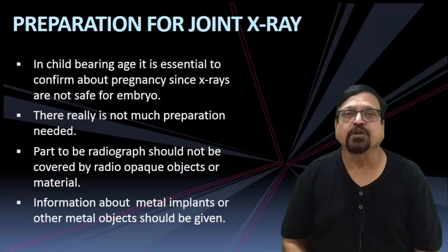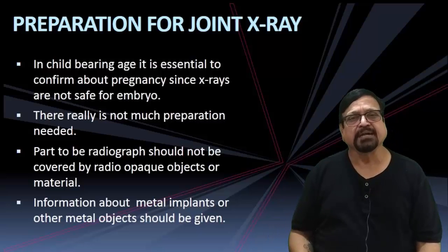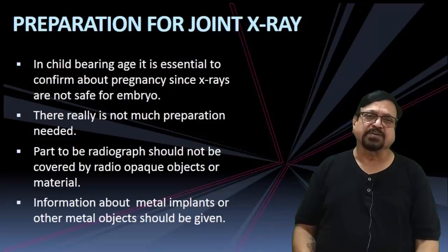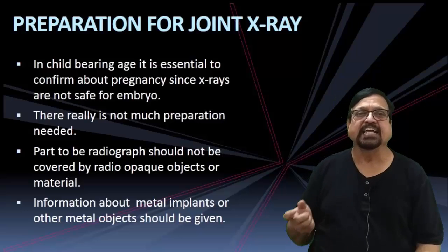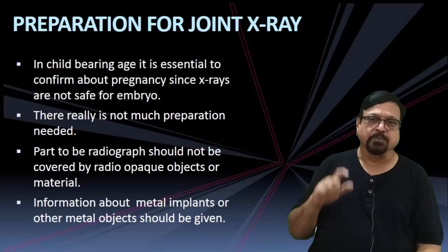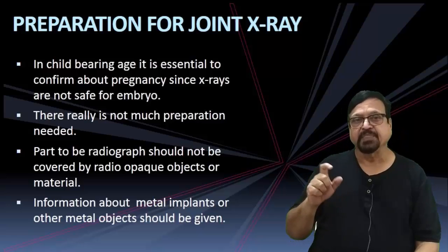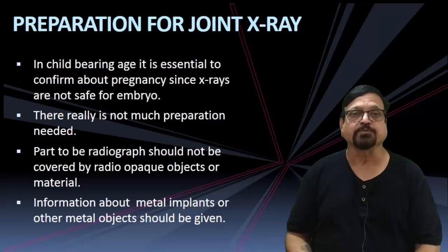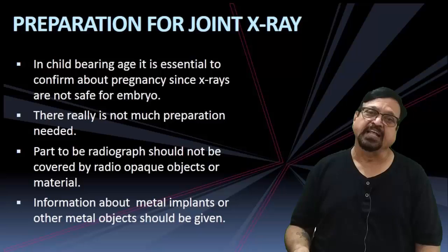Now information about metal implants can be given, but really it is not a contraindication, since there are not many artifacts produced by the implants used by orthopedic surgeons for treating fractures, and one of the indications is to know the situation or position of the implant. So that is not a real contraindication for plain radiography.